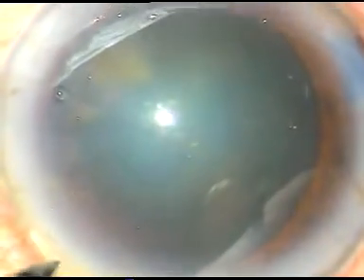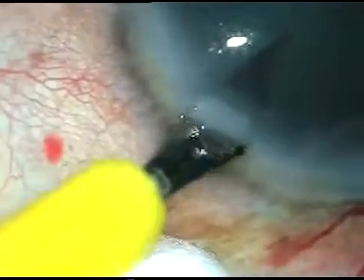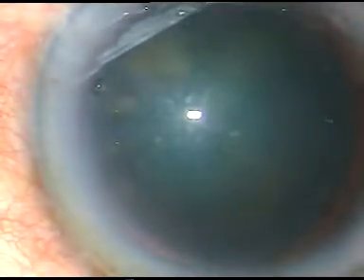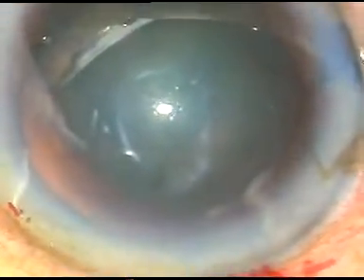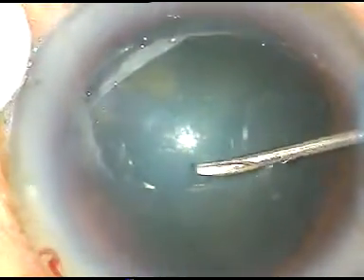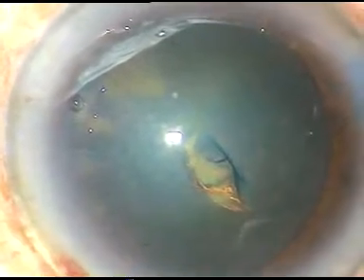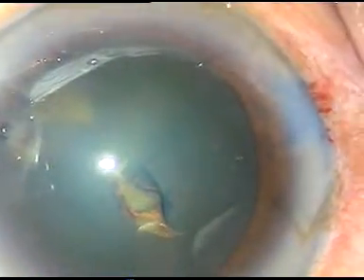Another sideport is made on the left side of the main incision for introduction of the chopper. Now the rhexis is to be made. I incise the capsule with this bent 26-gauge needle, raising a nice large capsular flap which is easy to hold with the utrata forceps.